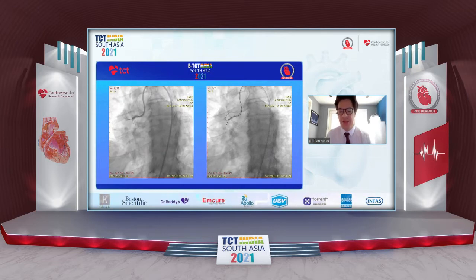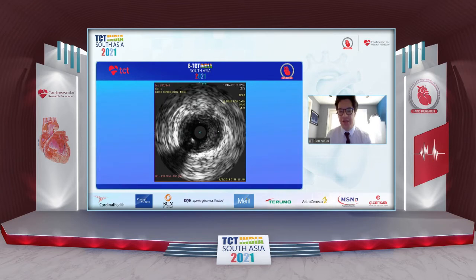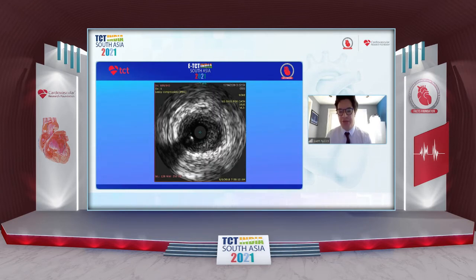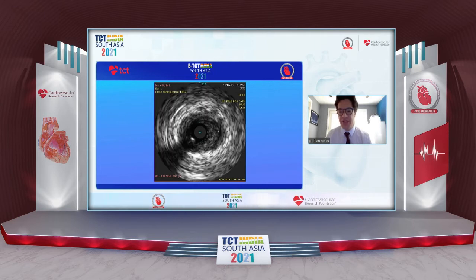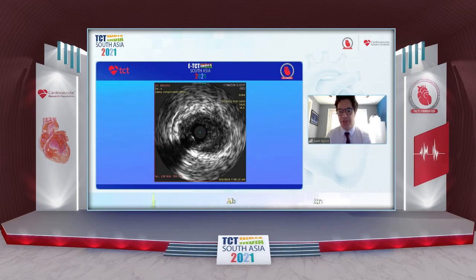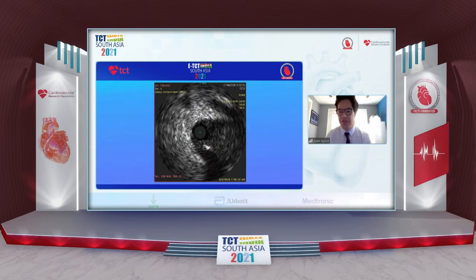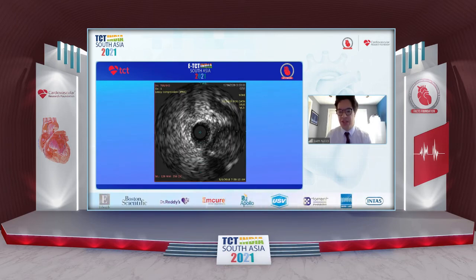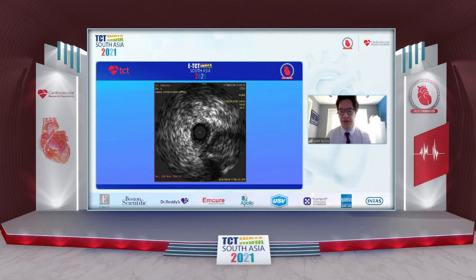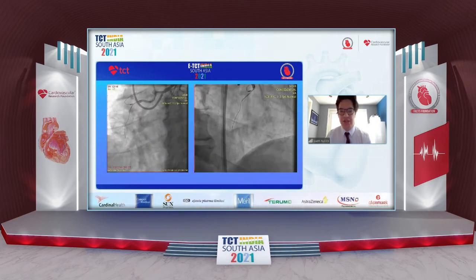Because the Eagle Eye is a manual deployment, here on this IVUS you can actually see the Eagle Eye in the side branch. As we pull back, you'll see the proximal cap of the CTO coming in at about 4 o'clock. And you can see that the wire penetrates the proximal cap at about 4 o'clock. We get a lot of information here: not a lot of calcification in the proximal cap, and we can see that the wire appears to be true lumen in that area. With this information in mind, we were very comfortable in advancing the Turnpike Spiral.